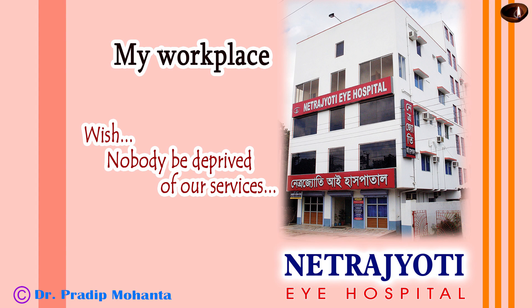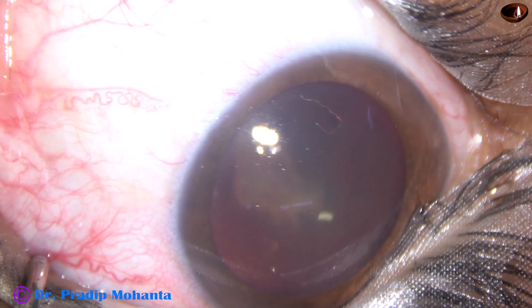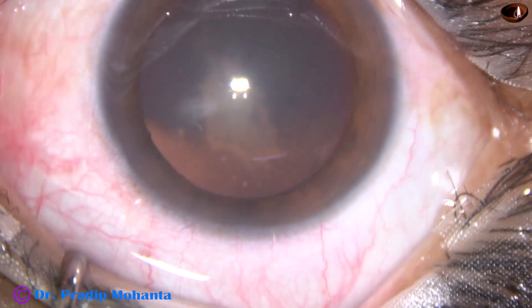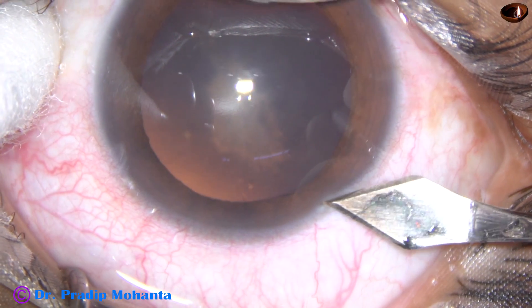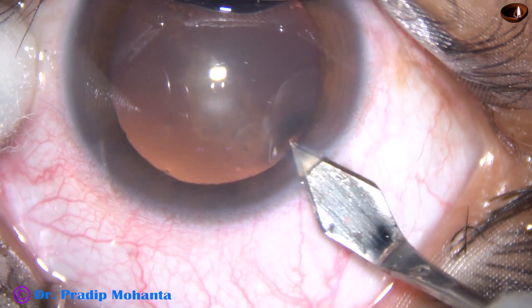Friends, welcome to my workplace at Rana Ghat, West Bengal, India. In this video I want to show phacoaspiration. Phacoaspiration means you can remove the lens matter just by aspiration — that is, using vacuum. You don't need any ultrasonic energy. You don't need emulsification of the lens matter to aspirate it.